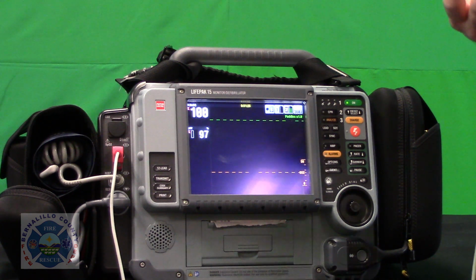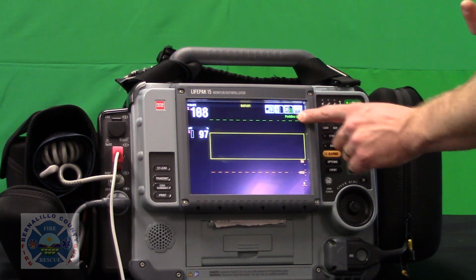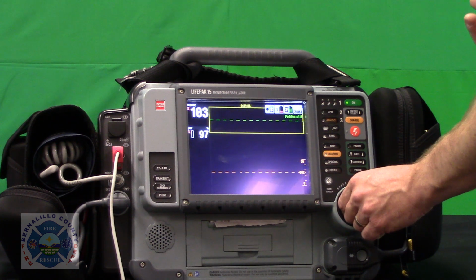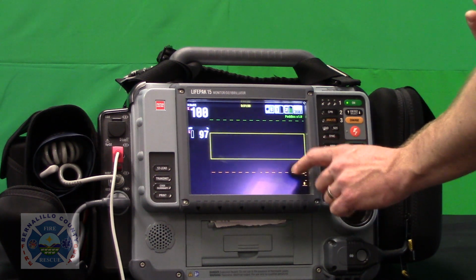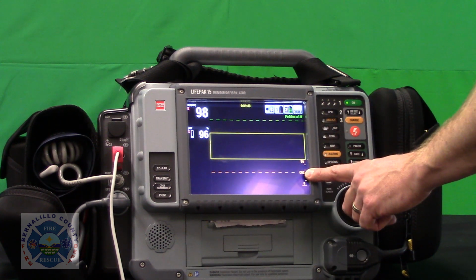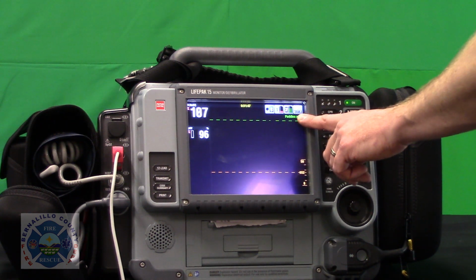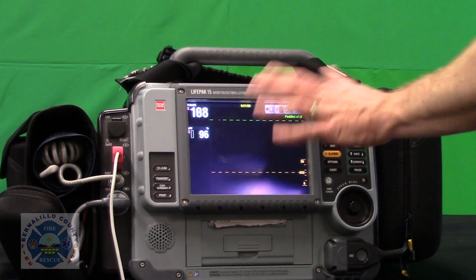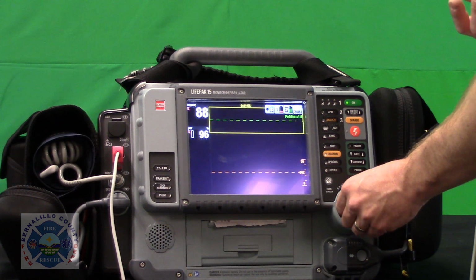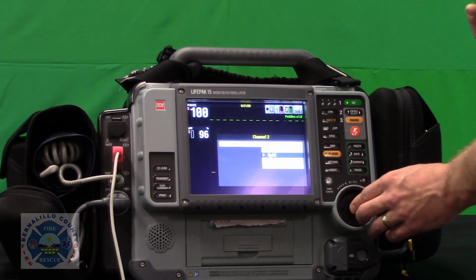What else can this probe do for me? Well, scrolling down to not channel 1, but channel 2 or channel 3 here, and by channel, I mean where you would get a normal readout for ECG or end tidal. I like to select channel 2 so that I'm still able to watch capnography later, and I'm able to see lead 2 as I continue my assessment, but we're not going to get into that just yet. I'm just still talking about pulse oximetry. If I scroll down to channel 2 and I change my waveform from none to SpO2, let's see what happens.